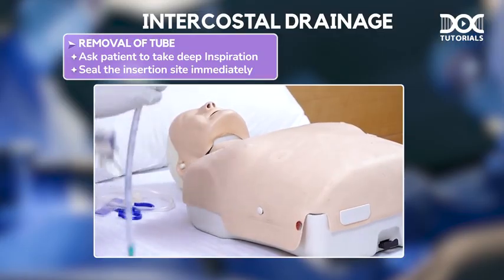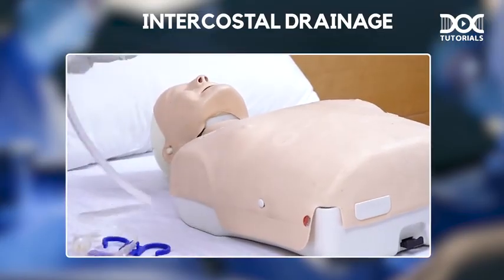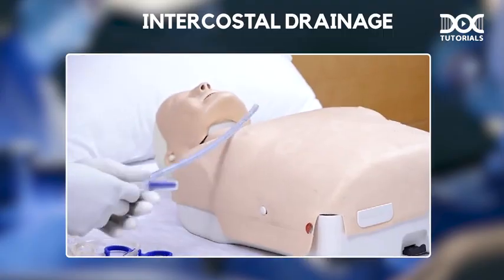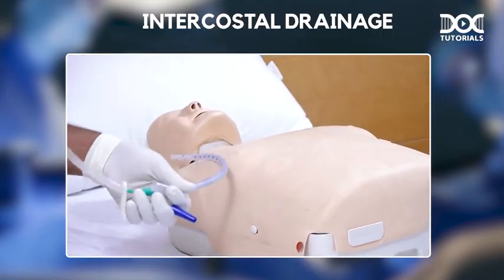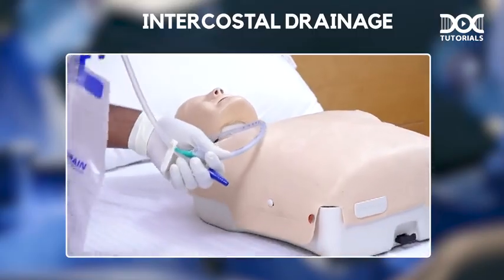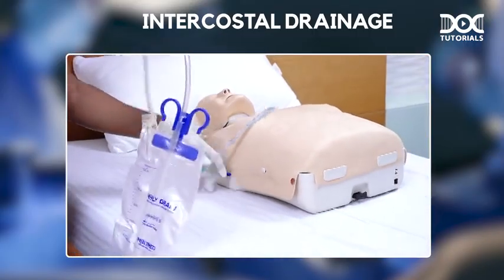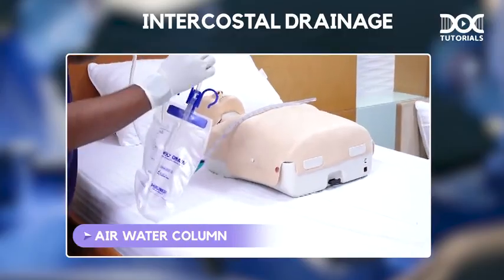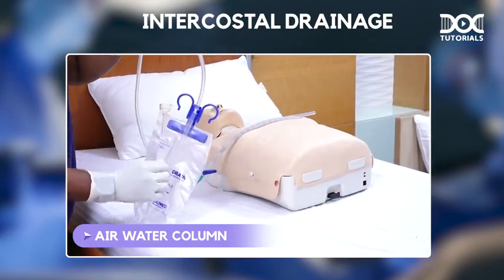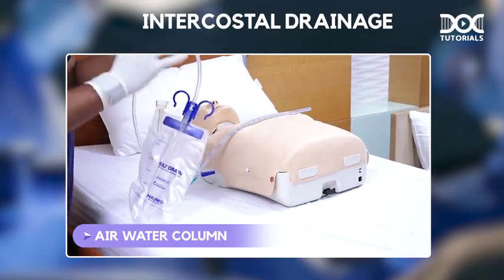And one important question which I have discussed in the theory part is, if I keep a tube like this and I am putting the tube like this, how to know whether the intercostal tube is functioning or not? I can say the tube is functioning or not by seeing the air-water column will be here. That will be moving up, moving down, moving up, moving down in the case of a functioning intercostal drainage tube.